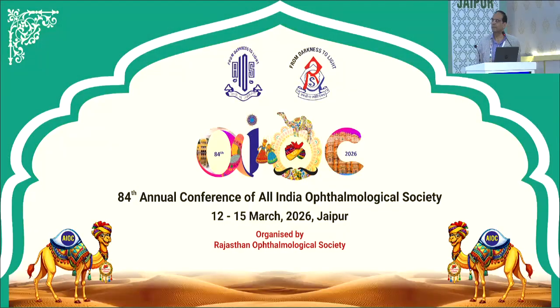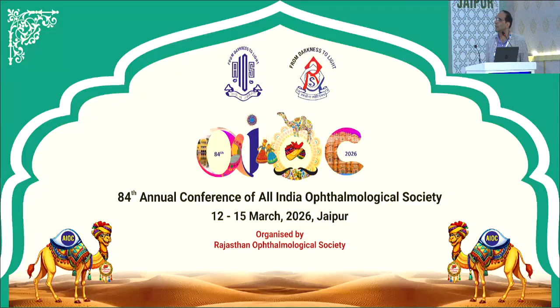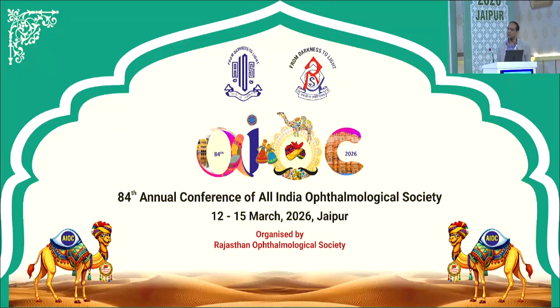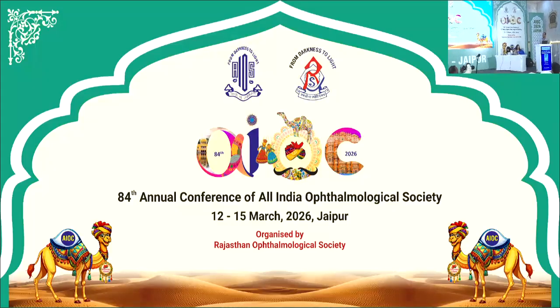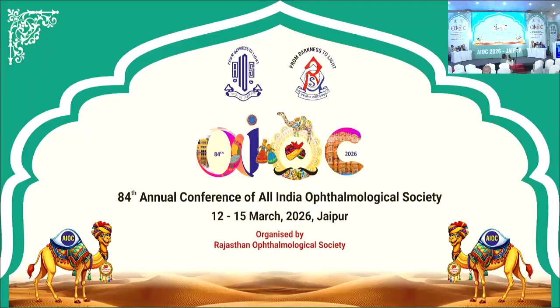Nice presentation. Basically, two things. Did you do a vitrectomy, an anterior vitrectomy? This was already a vitrectomized eye, sir. Okay. The advantage, and why we have shown this video, is that initially in our center only SFILs were being done by posterior segment surgeons. But this technique is relatively simple because you need an AC maintainer. You don't need to put in a trocar. And it can be done by anterior segment surgeons. So we have started training our fellows also, so that SFILs can now be done by the anterior segment team.